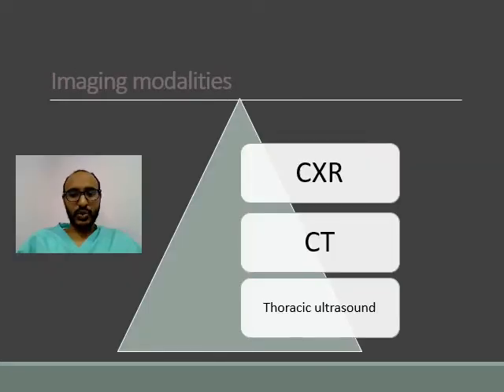Imaging modalities used in COVID-19 are mainly chest X-ray and CT scan. For CT scan there are different protocols: non-contrast CT, high resolution CT, and CT pulmonary angiography.